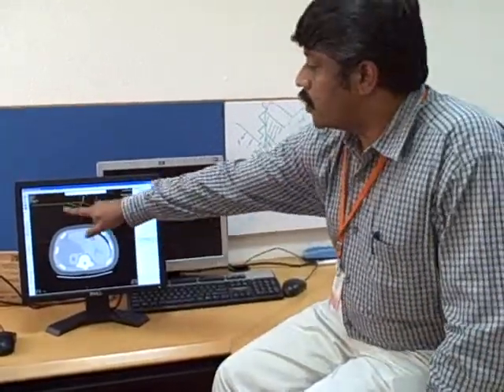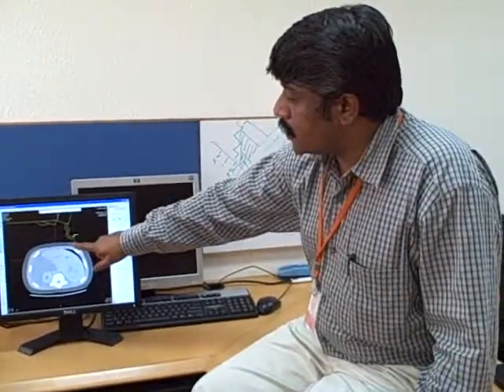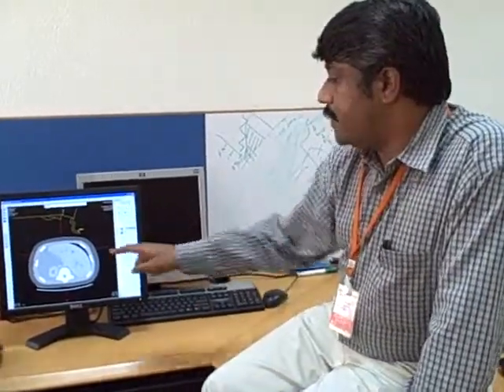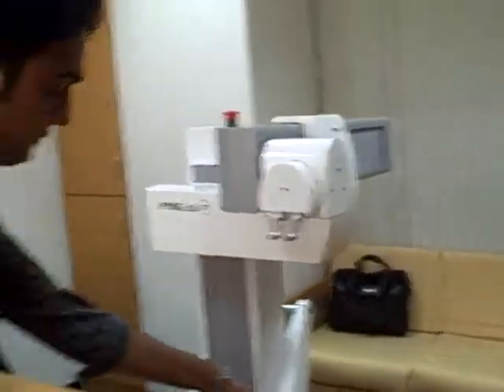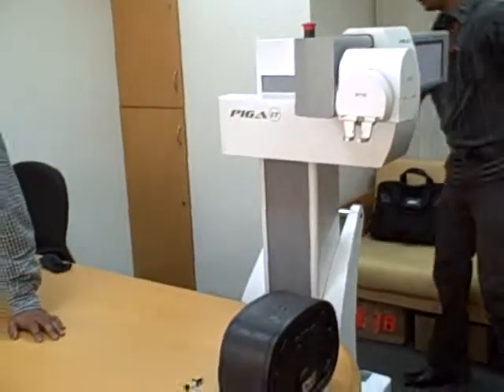And so it also shows right now, for this plan, will the robot touch the patient or will it stay away from the patient? You cannot have the equipment touch the patient. It should stay minimum. So as long as this does not touch the surface, you are having a safe plan. Okay, so let us say we confirm that this plan is all right. You confirm by sending the coordinates to the system. So now the machine is ready for operations. The coordinates have all been sent here. So you proceed.